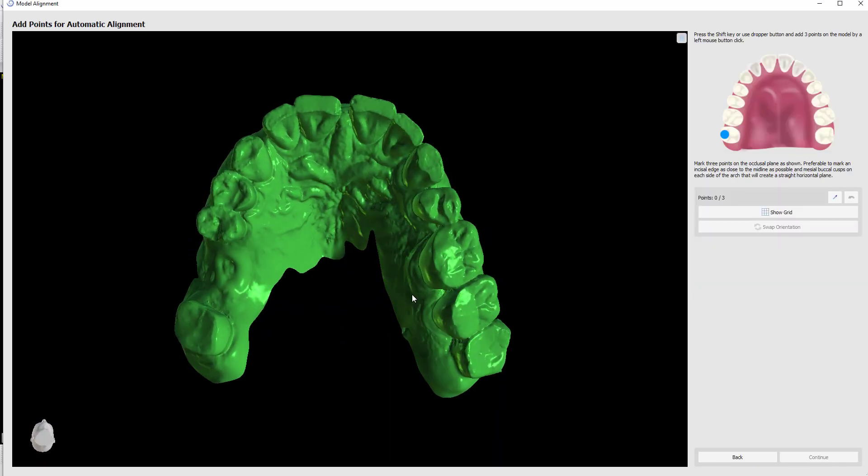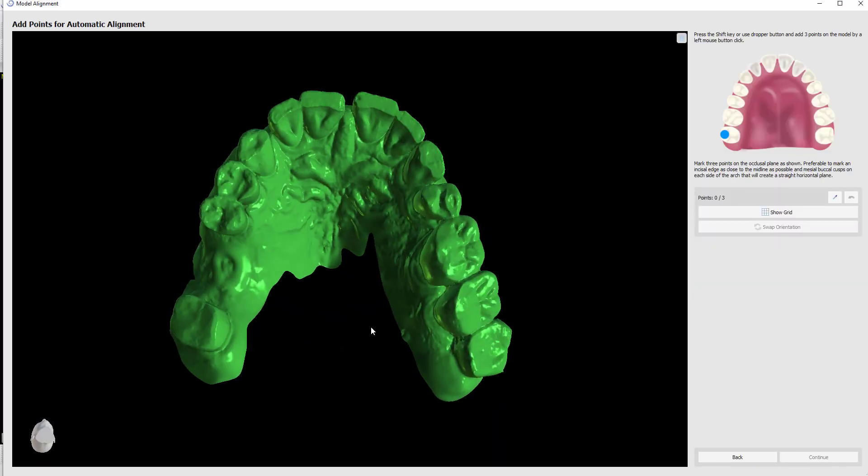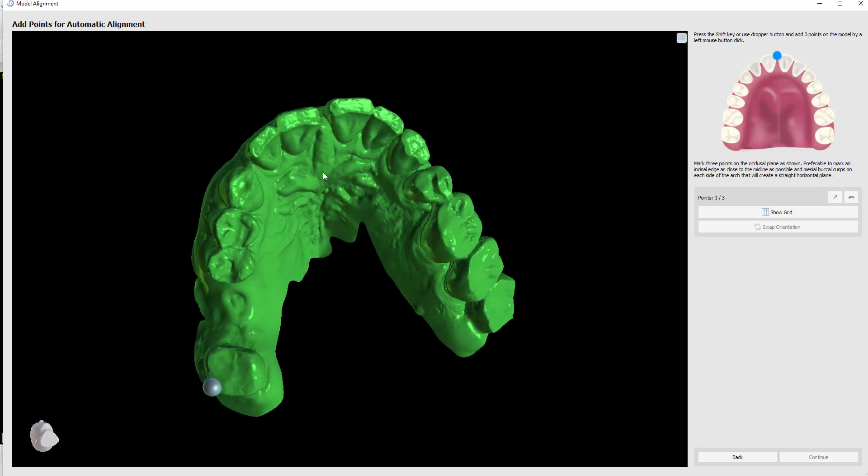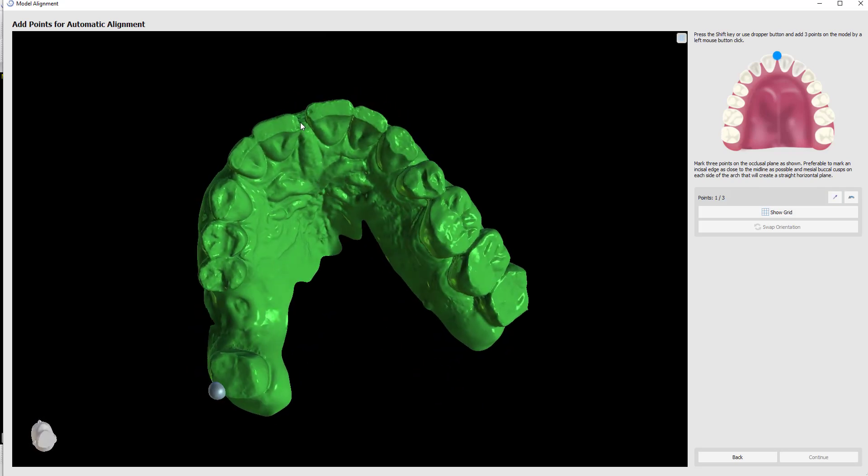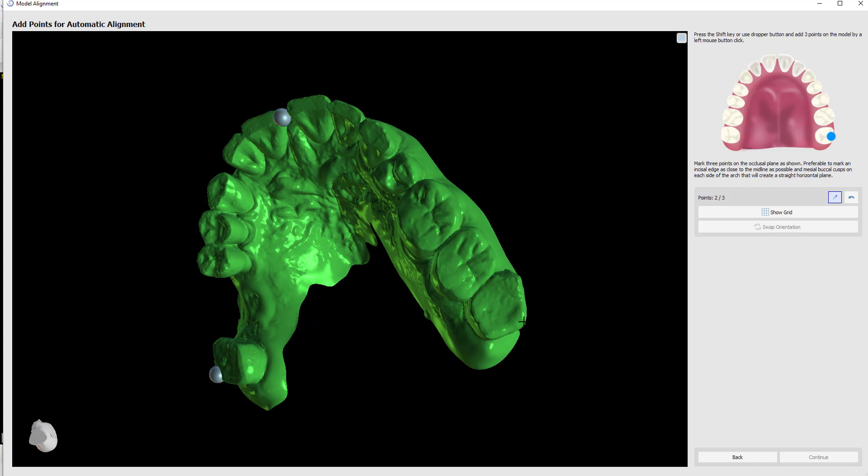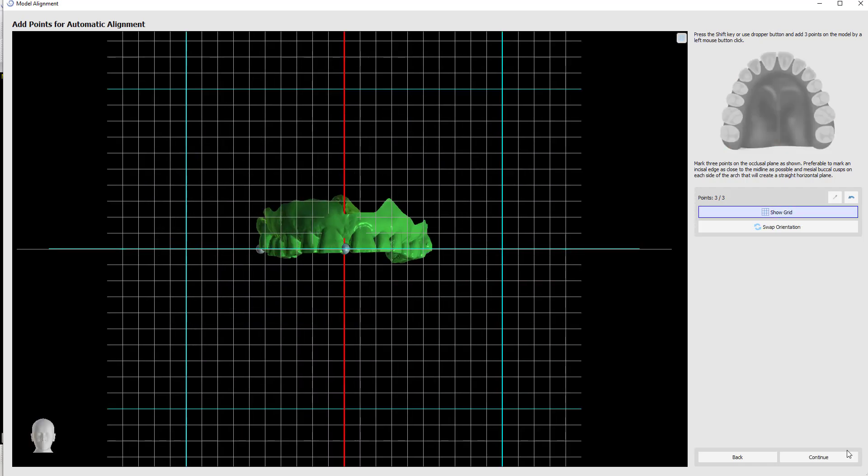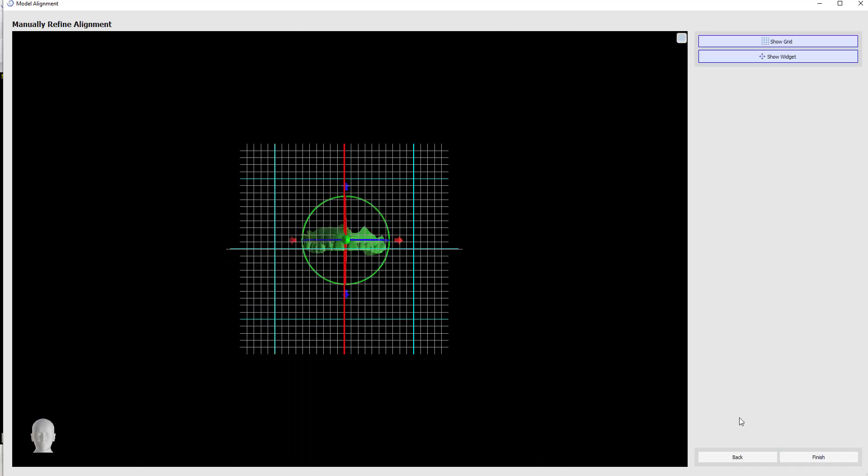I'm going to mark three points. One side of the arch, middle, other side of the arch, continue, and finish.